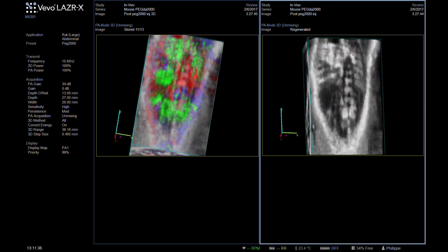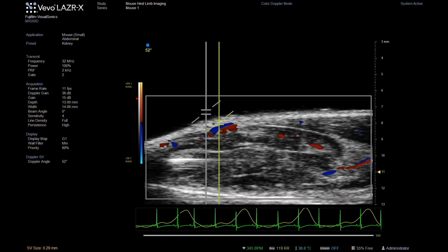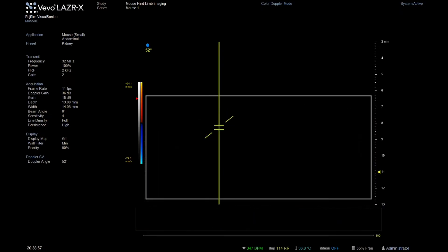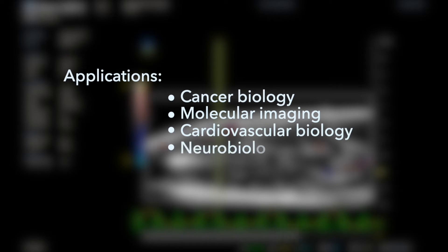For example, you can choose to image the whole body or just a small area of interest in a variety of animal models for many different applications such as cancer biology, molecular imaging, cardiovascular biology, and neurobiology.